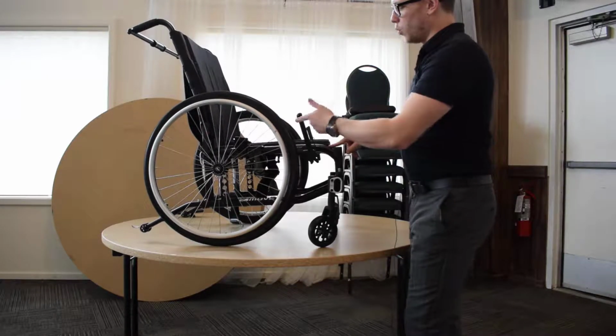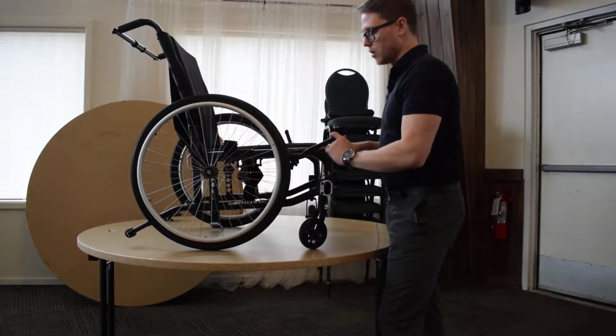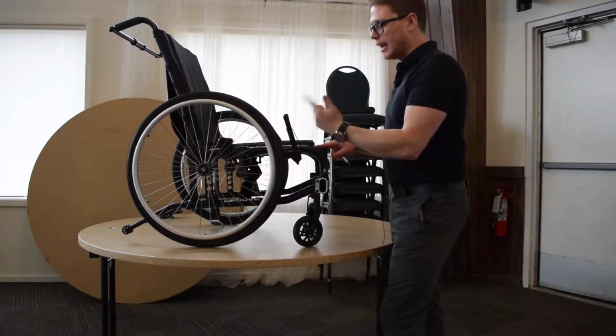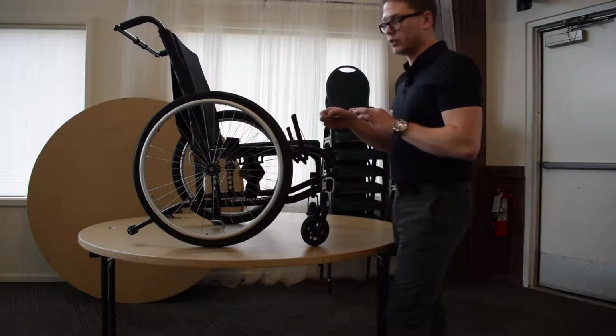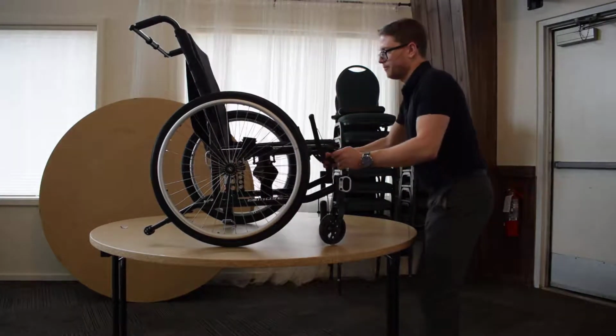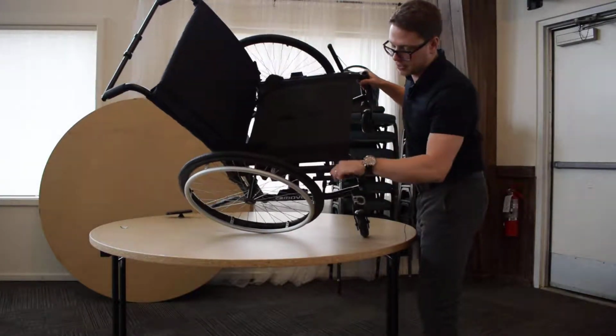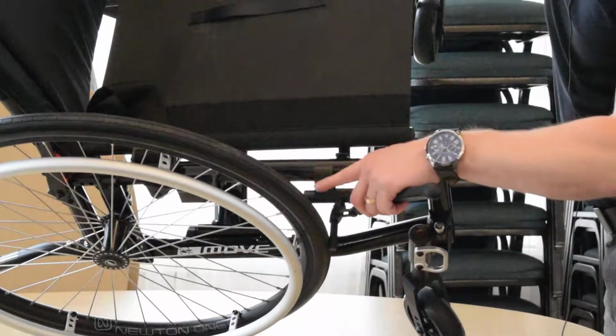Okay, so wheel lock adjustments are probably some of the most common adjustments that we do on a wheelchair in general. On any of the Motion Composites chairs, you're going to need a 5mm Allen key in order to do that adjustment. On the top here, we have 2 bolts, which if I flip that upside down, you're going to see you've got 2 bolts here, and that's where your 5mm Allen key comes into play.